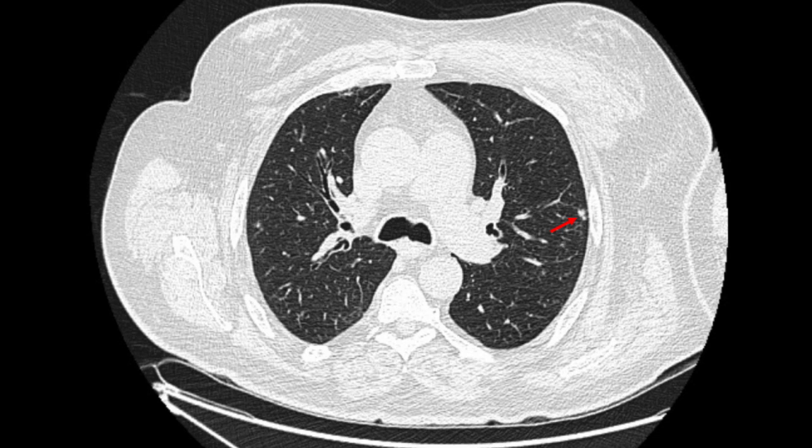Here, in this red mark, we could see the nodule less than a centimeter. This is the biggest one, and this is the nodule that was resected.